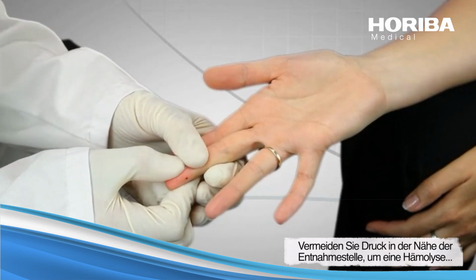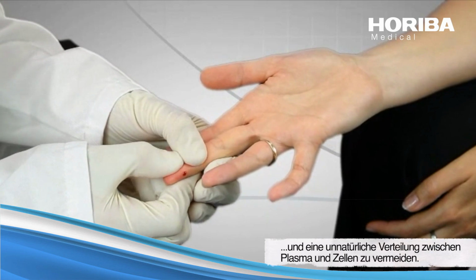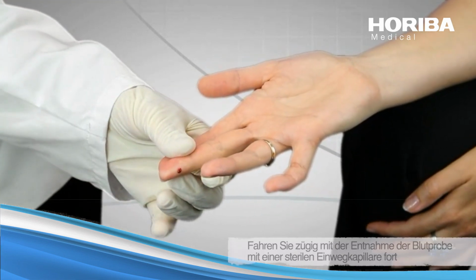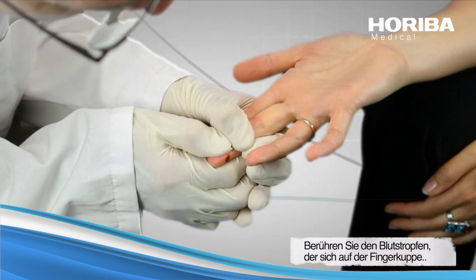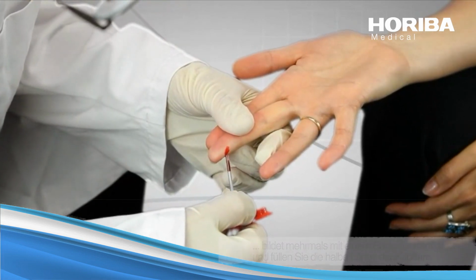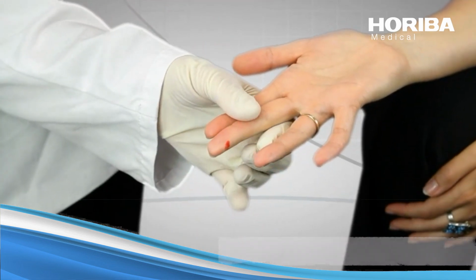Avoid pressing the pad near the withdrawal site in order to prevent hemolysis and an unnatural distribution between plasma and cells. Quickly proceed with the withdrawal of blood sample using a sterile disposable capillary. Touch the drop of blood that forms on the tip of the finger multiple times with an end of the capillary until filling about half of the length of the capillary.